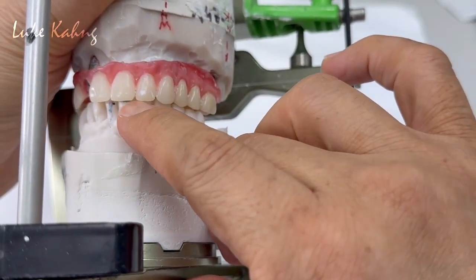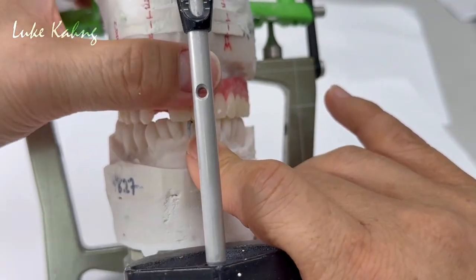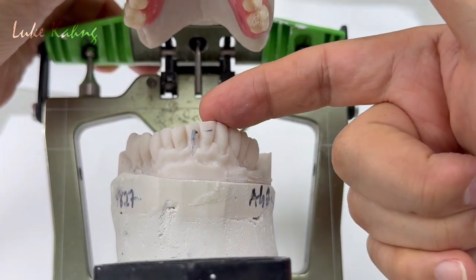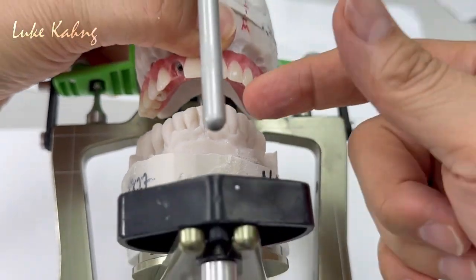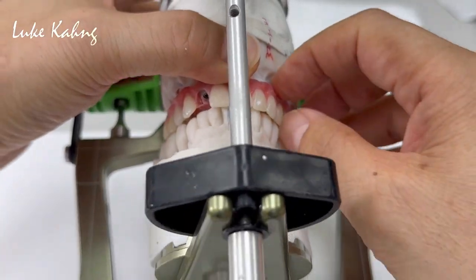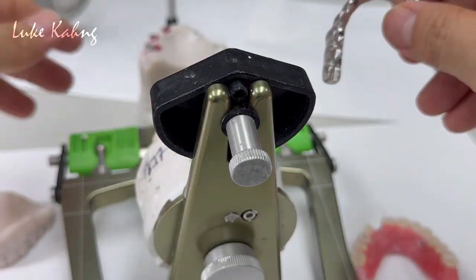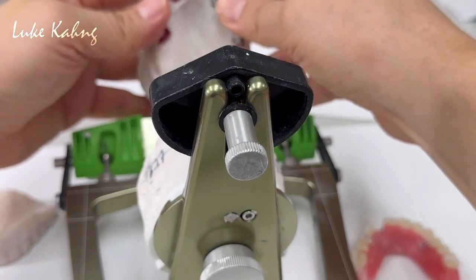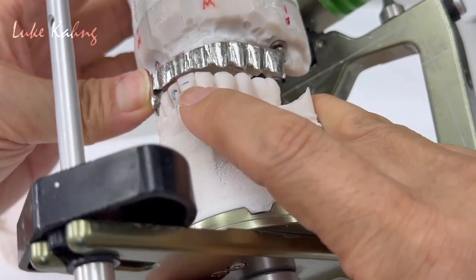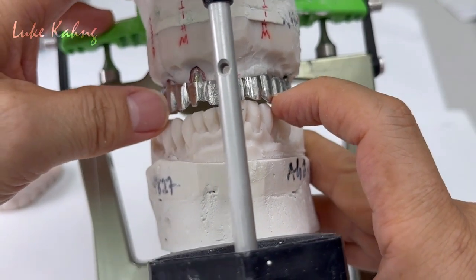So I mark it here with a pencil — the midline here, which is a little bit off. Another problem is this slant right here; I have to make more room, and then maybe I cannot get — probably need a little bit more open here. Anyway, this is a guideline, and this is a conversion guideline. We can try to see how much we can open that area. Like I said, there's a lack of room, so we're trying to open it up and then make the canine-to-canine sit better.